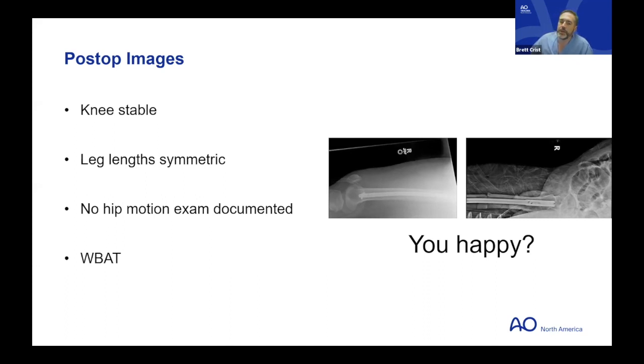So, Matt, what are your thoughts? What would you do at this point? So I think it's really important to engage the patient, right? So it matters what they're experiencing. I mean, we're doing this fireside because we've recognized that getting rotation right is difficult. And even the things that we're talking about, the lesser trochanteric profile, the physical examination, the cortical step off, none of those things are very sensitive or specific. And so we can't hang our hat on any of those things.